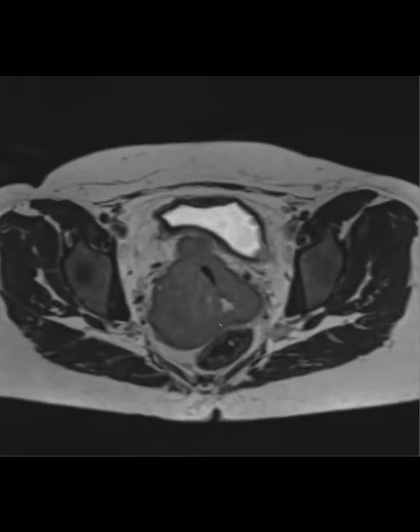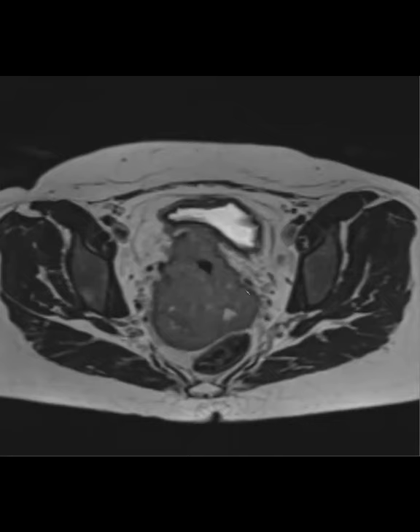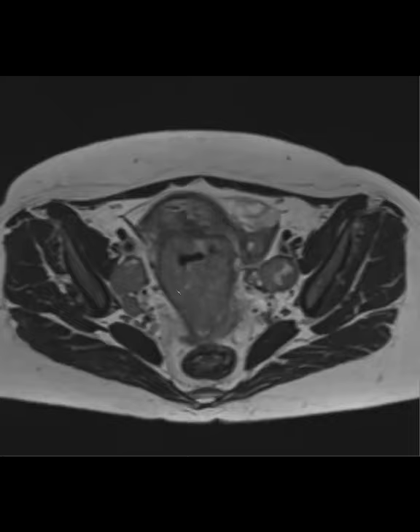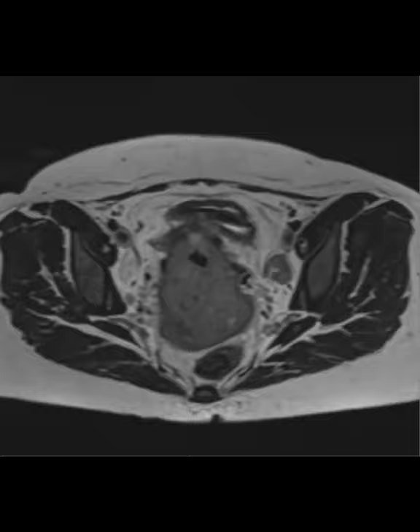One interesting thing is that when we're staging these, especially by MRI, we are going to be looking for parametrial invasion. So basically, invasion into the space around the cervix here. But in this case, most of it is kind of bulging endocervically, and we can still see this T2 dark line along the edge. So if this was just the mass, I'm not sure. I mean, it's so big that we know that, and it's also larger than 4 centimeters, which is another part of the T staging. But just the fact that we can see this T2 dark line, at least the parts that I see here, I don't see any definite parametrial invasion.